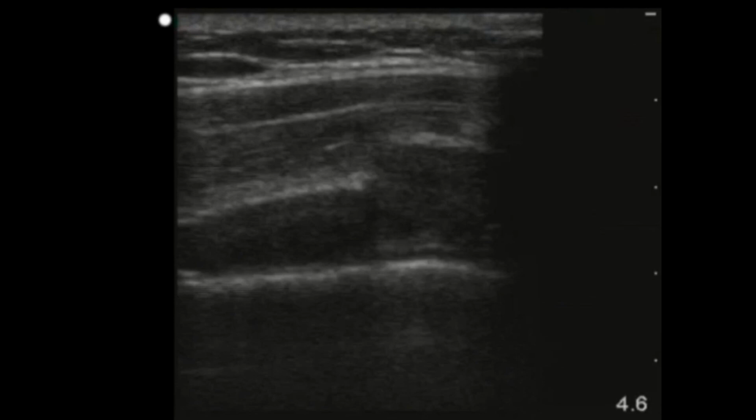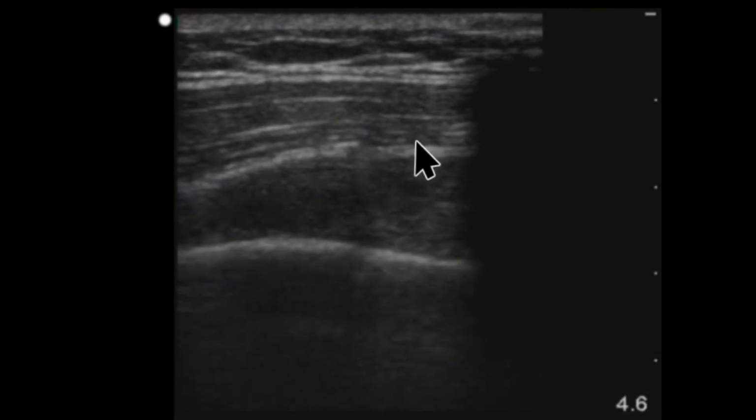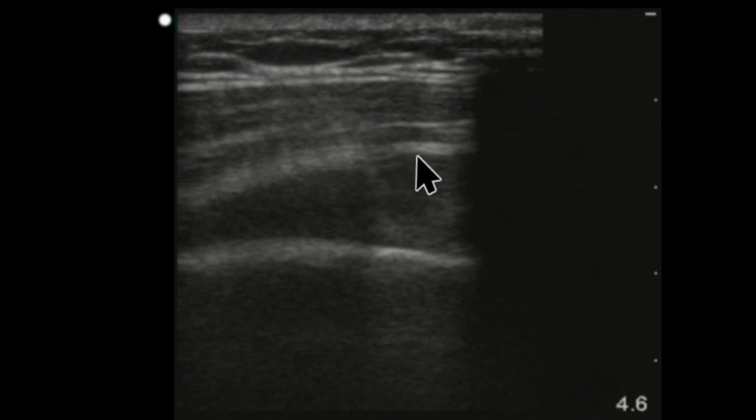One can actually perform fracture reduction under real-time ultrasound guidance. Here we are bringing this bone end so it comes down to come in contact with this bone end. And we slide it right down into place. And now these two bone ends are lined up.